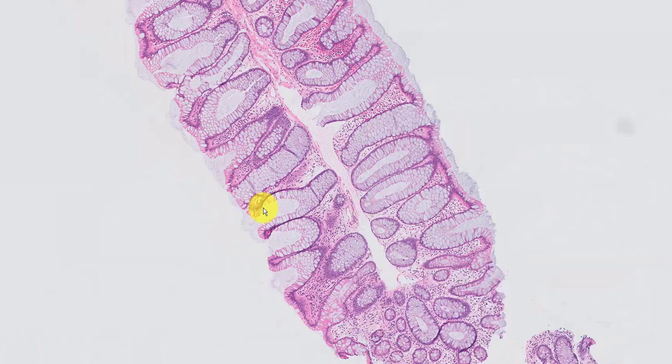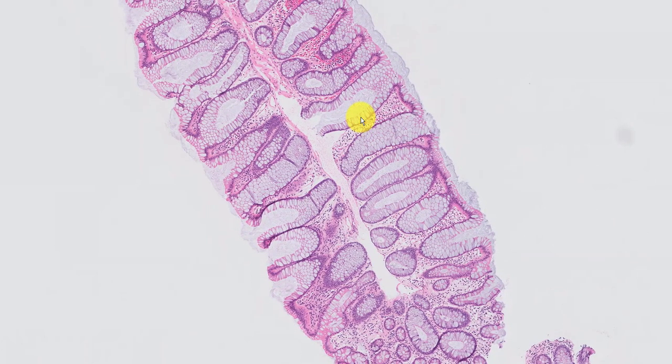But conceptually, it's very useful to hold these subtypes at the back of your head simply because these various variants of hyperplastic polyps, as you can see here, look somewhat different. These goblet cell rich hyperplastic polyps do not show that overt serration that a microvesicular variant of hyperplastic polyp will show.